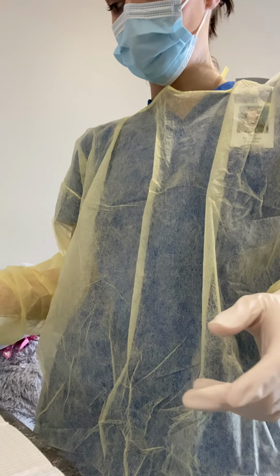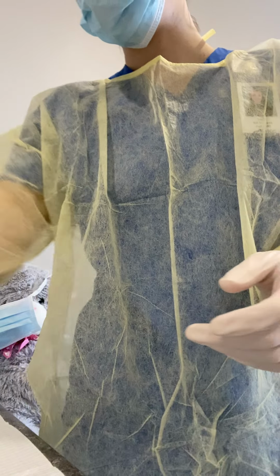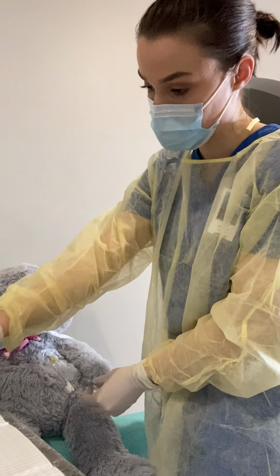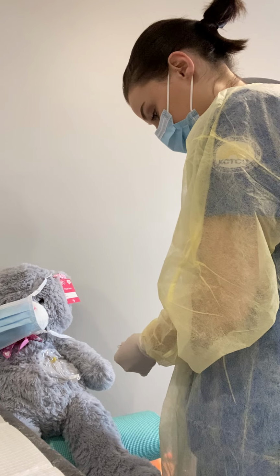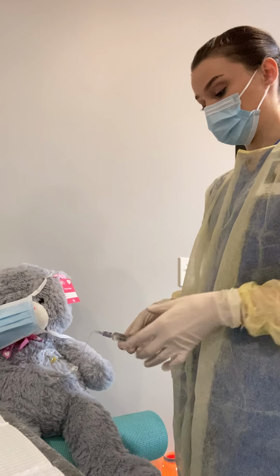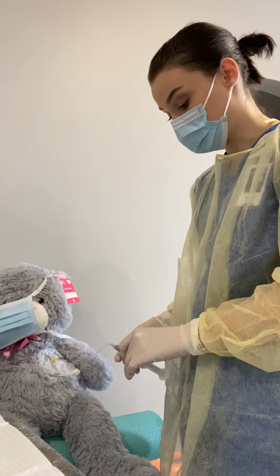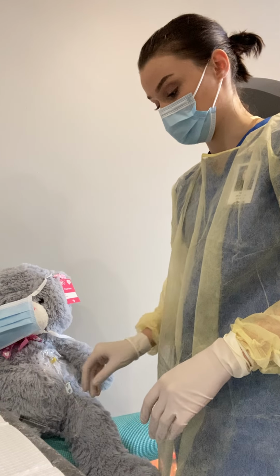So I'm going to take a syringe, going to get my alcohol pad, and I'm going to scrub the hub. Going to attach this. And I'm going to pull back 1 cc, so I'm going to get blood. Then I'm just going to go ahead and flush the rest of this normal saline. So that's what I'm going to do for that one. I'm going to go ahead and leave that normal saline connected.